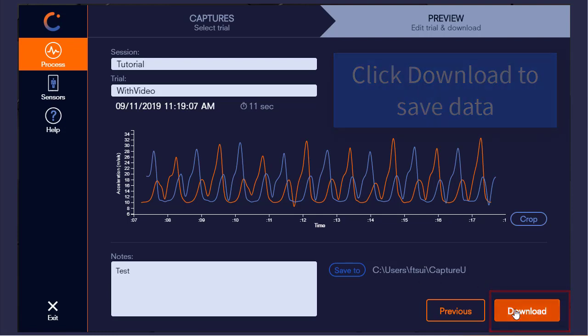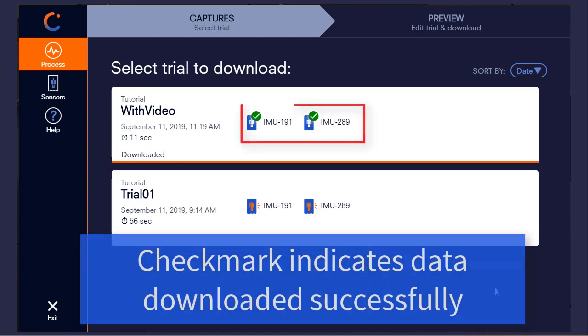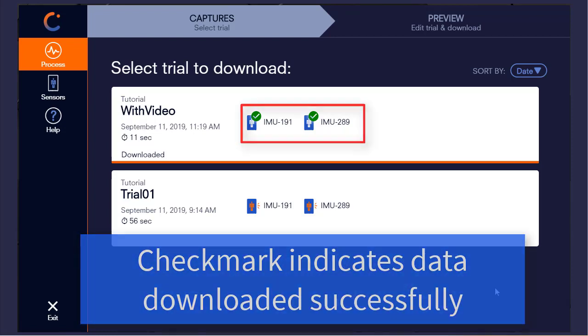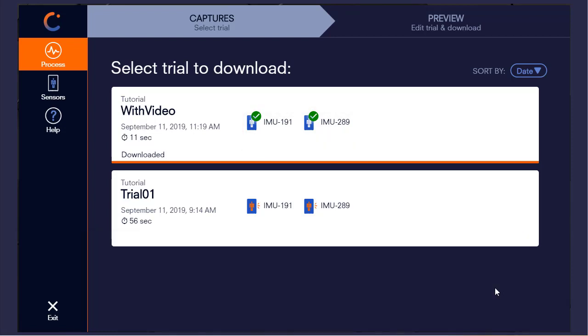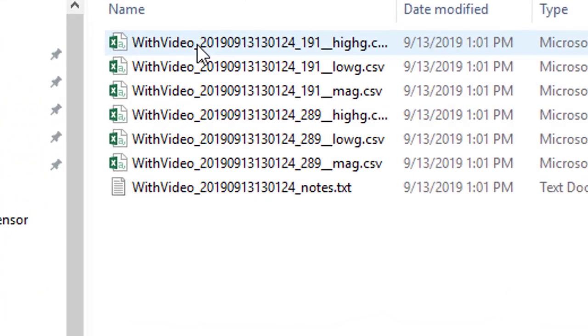After clicking download, we will be brought back to the trials list and we'll see the download status of each sensor. The check marks indicate that both sensors were successful, and if we open the Windows folder, we will see the session folder with all of the trials inside of it.